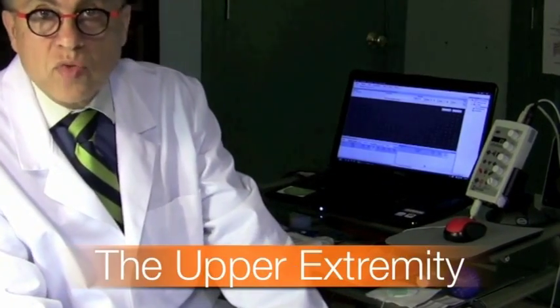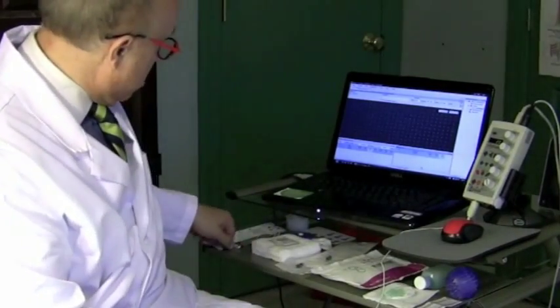So now we're going to get ready to do the studies. As I said, in the upper extremity, we're going to do the median nerve, the ulnar nerve, and the radial nerve. Now, before I start the study, what I like to do is to measure and use a pen to mark up the spots where I'm going to put the electrodes. It's much simpler to mark up the spots in the beginning, because you're going to be using cream.